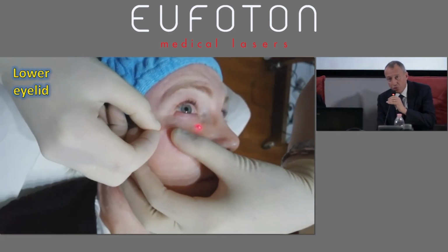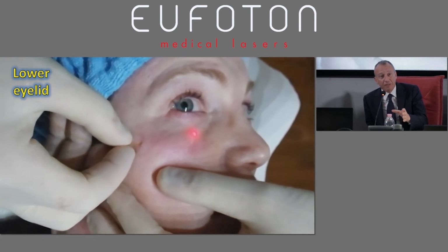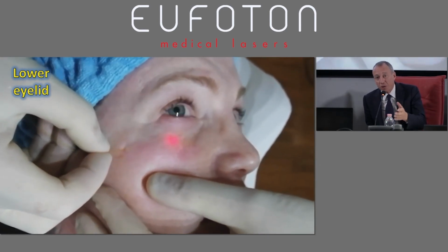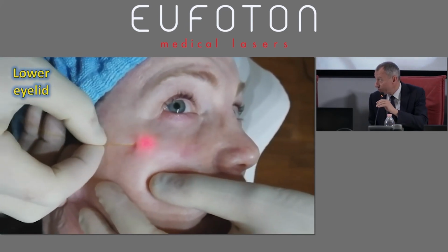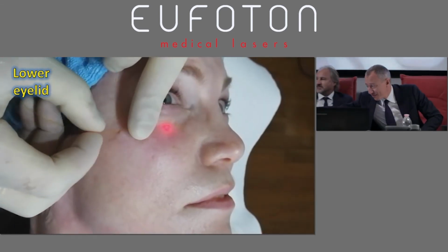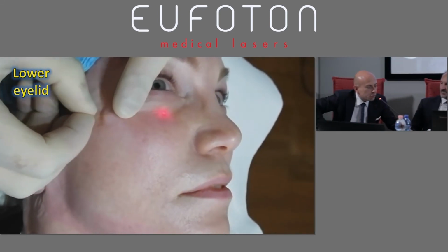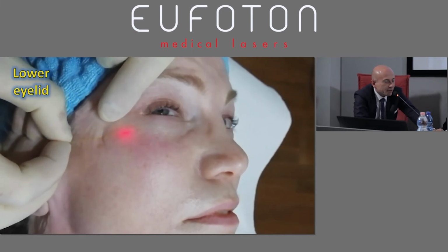I have not had large experience with that. Now we just use the disposable fibers. We just dispose of the disposable fibers. We don't use multi-use fibers anymore. When we used multi-use fibers... I give the mic back to my colleague. Well, now, it's important to say a few words.